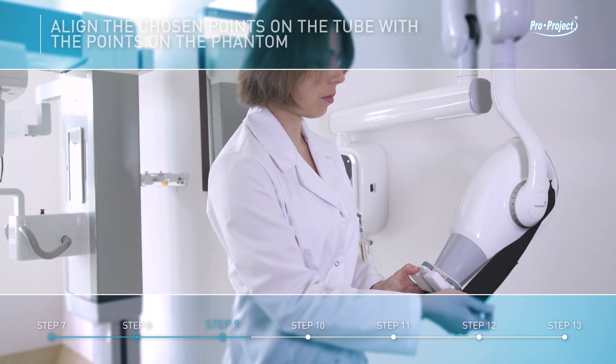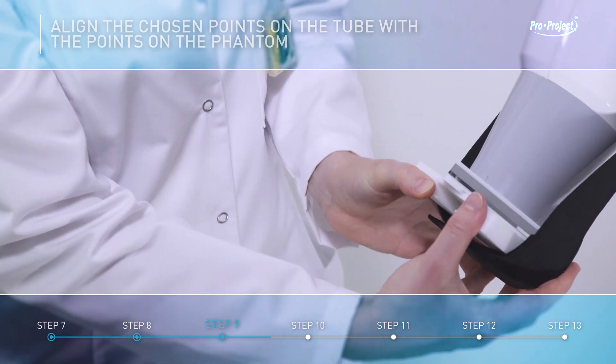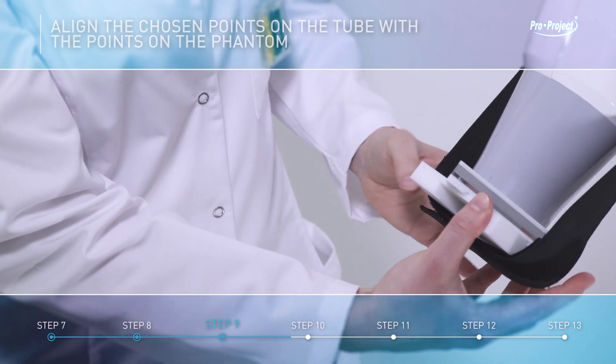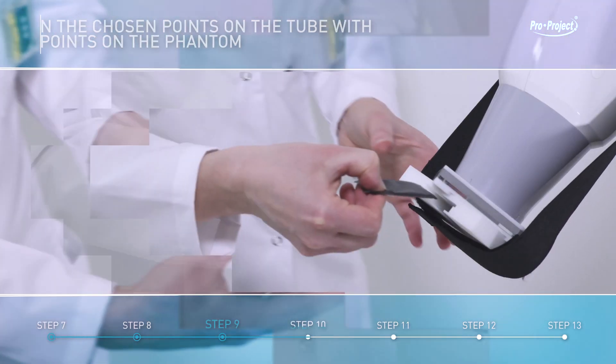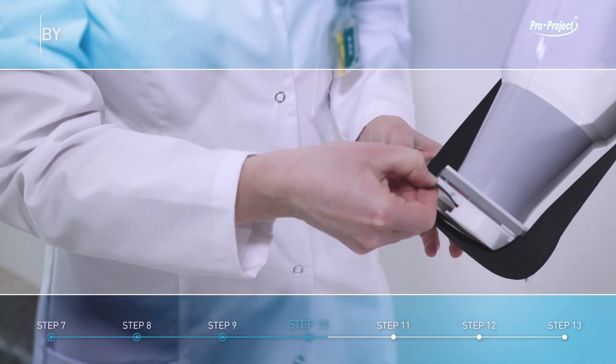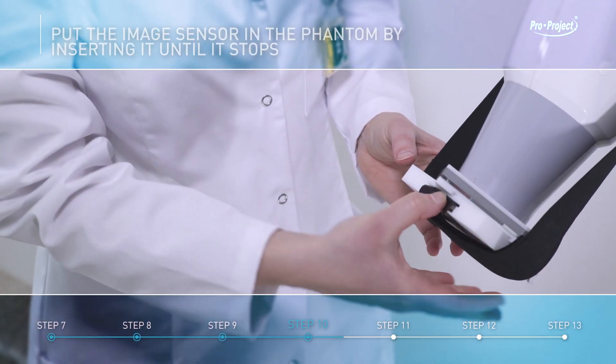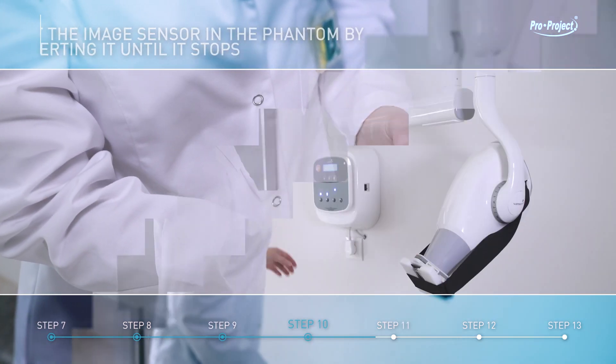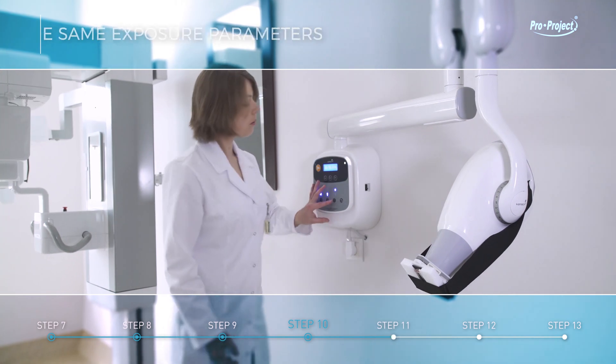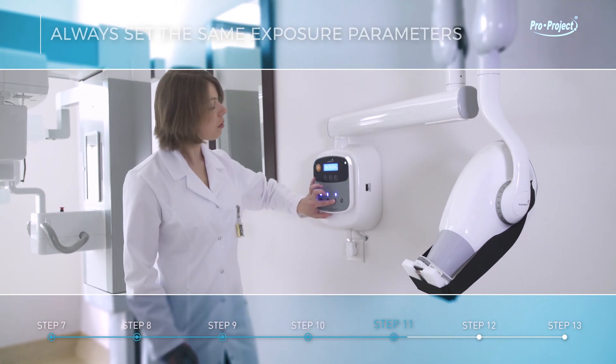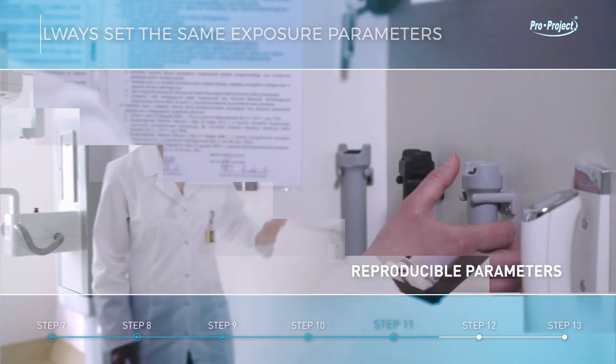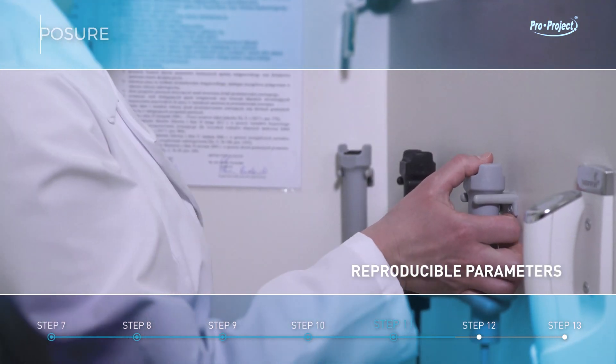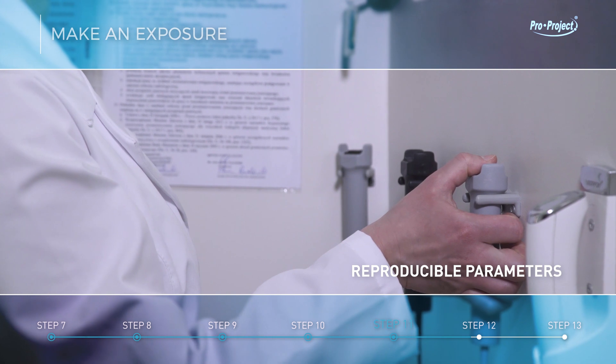Align the chosen points on the tube with the points on the phantom. Put the image sensor on the phantom by inserting it until it stops. Always set the same exposure parameters. Make an exposure.